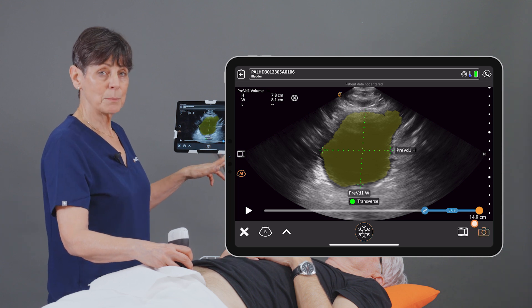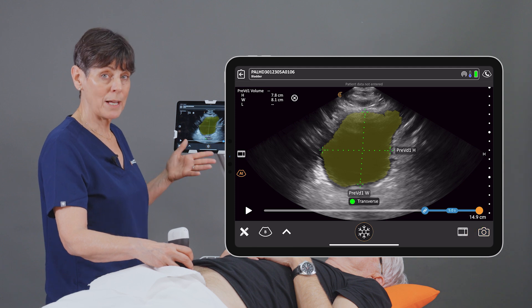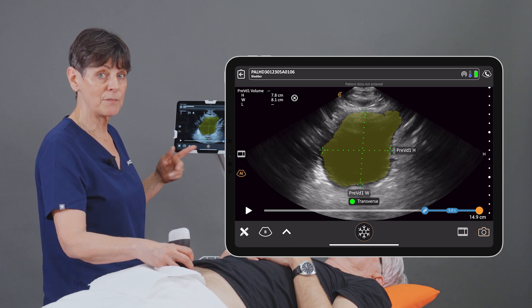The camera icon is flashing at the bottom right. This is prompting us to take a picture, and as well, this will save the measurements that we've done for the volume calculation.